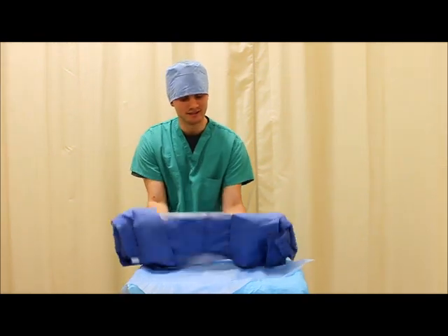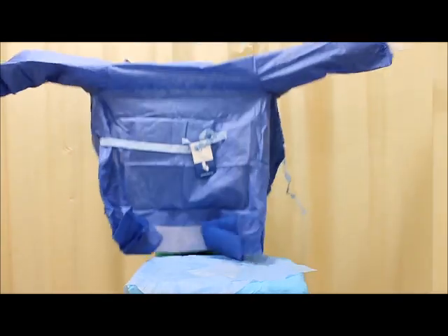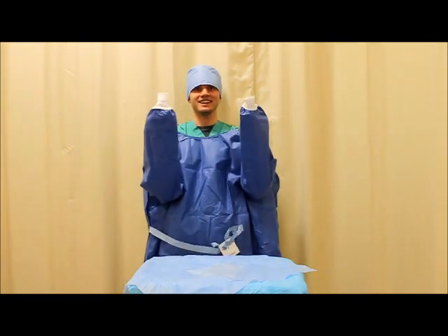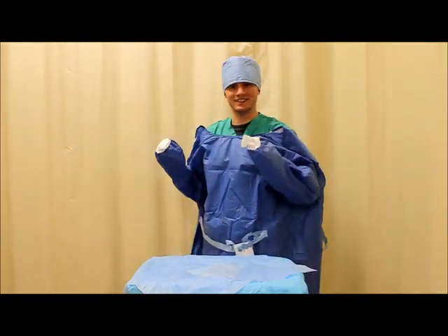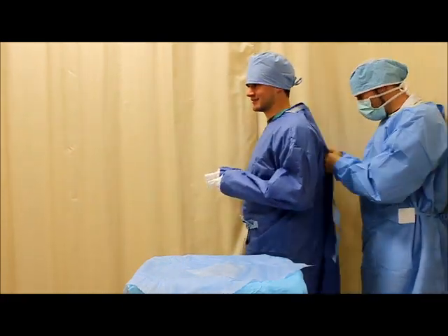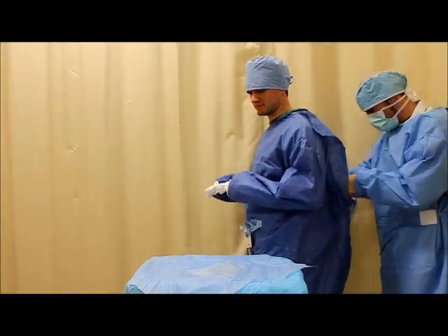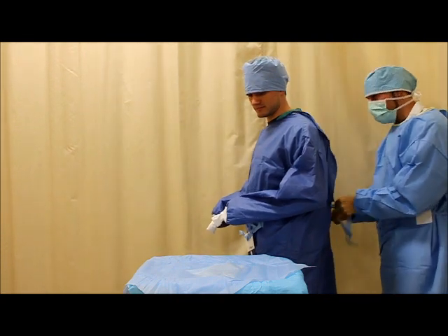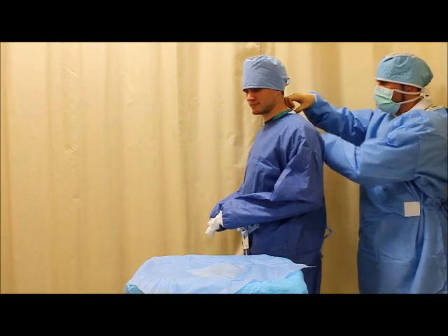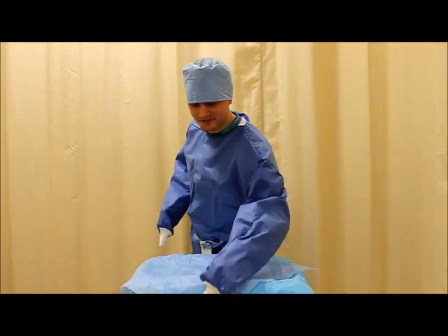And we're going to put our hands in here. And the important thing is just not to touch the outside of the gown and to keep your hands inside the gown at all times. And then you actually need an assistant to help. There you go, doctor. Now that the gown is tied, you can put on the gloves.